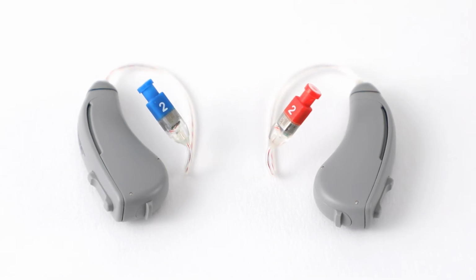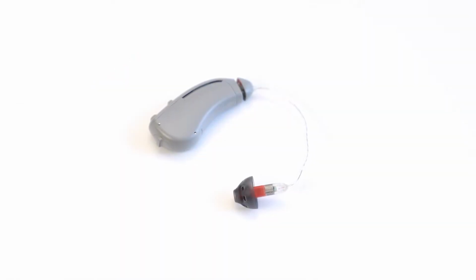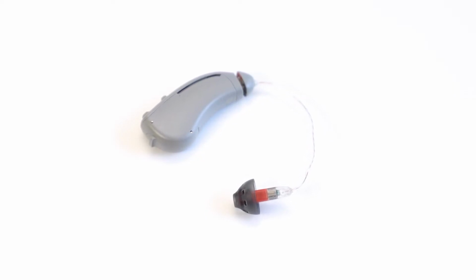We recommend replacing the hearing aid cables every year. If the cables appear damaged, don't connect securely, or if you experience poor sound, the cables may need to be replaced sooner.